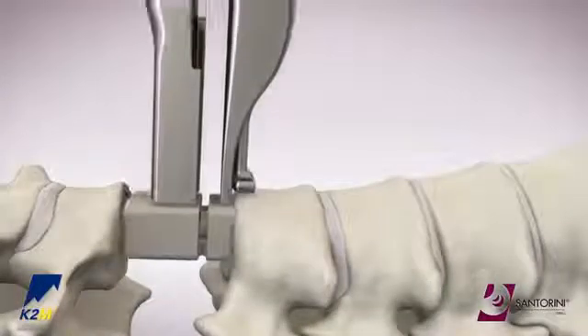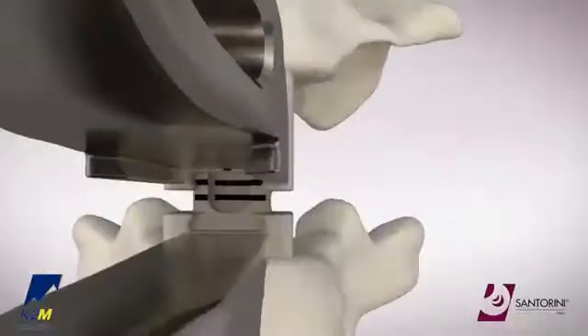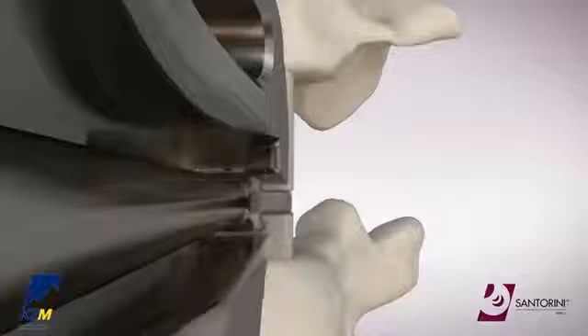Place the cage in the site and turn the proximal knob to distract. Use the clip trials to confirm the overall expanded height of the cage. The appropriate clip trial will not have any space between the trial and the dovetail on the cage.